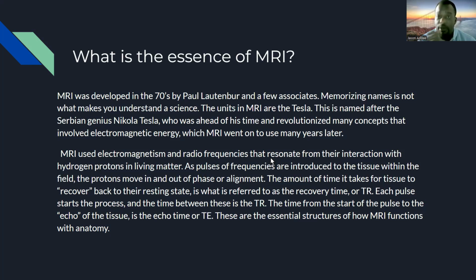That's why of the myth that you hear about, can you image a mummy? The answer would be no, because there have to be active hydrogen protons in the matter. Now, consider the amount of time it takes for tissue to recover back to its resting state. You have a magnet with these hydrogen protons. Those protons are excited with an RF pulse, a radio frequency pulse. After that excitation pulse, they return back to their original state. That's the recovery time, and however long that period is dictates the type of tissue that it is.